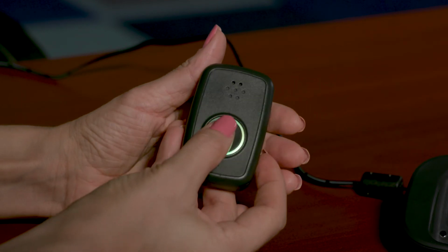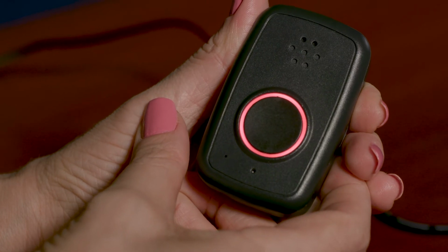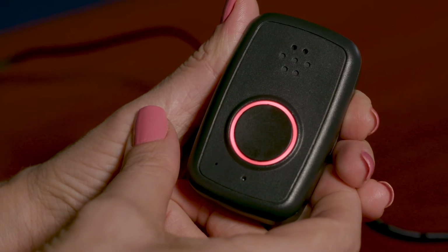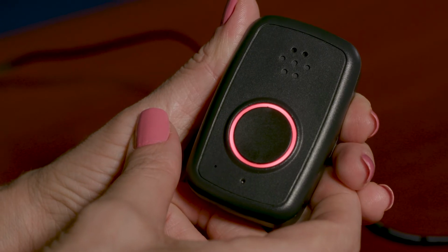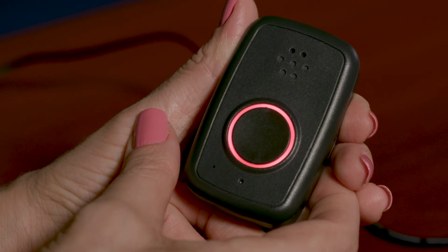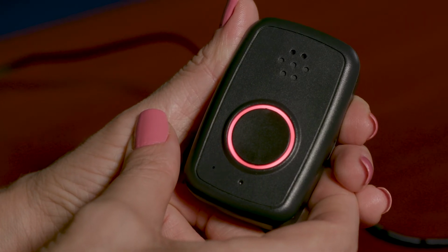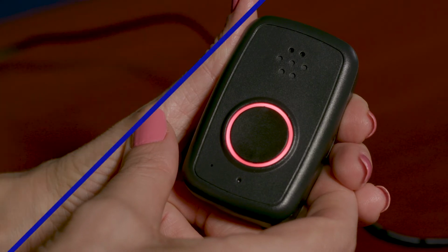Now press and hold the round emergency button for 2 seconds until it lights up red. The micro should say, "Test call sent to Emergency Response Center," and then, "Call connected. Please stand by for an operator," and then, "Thank you for testing your device. Your test is now complete. We're all set. Thank you and have a great day."